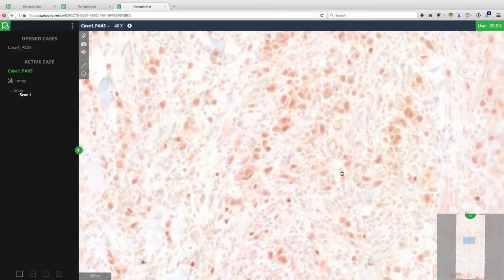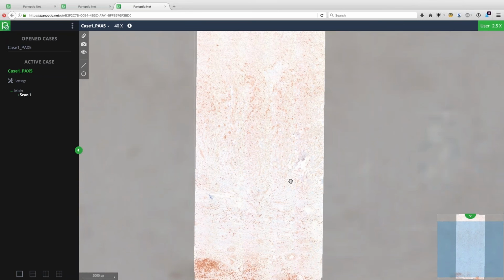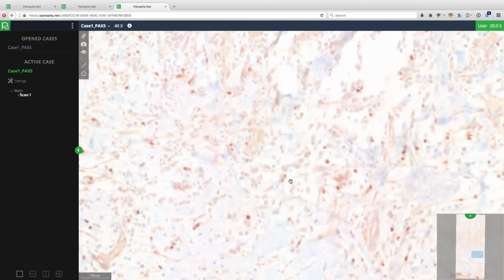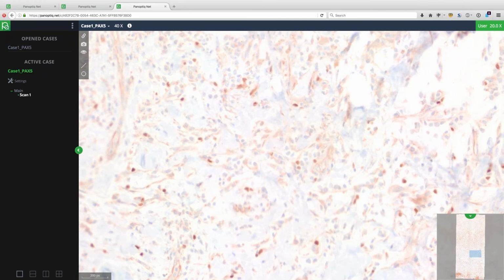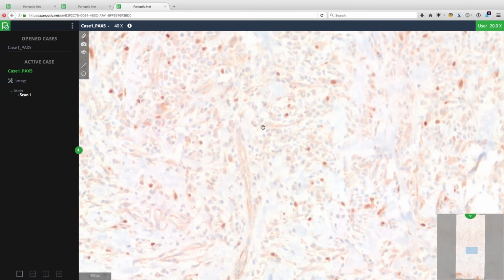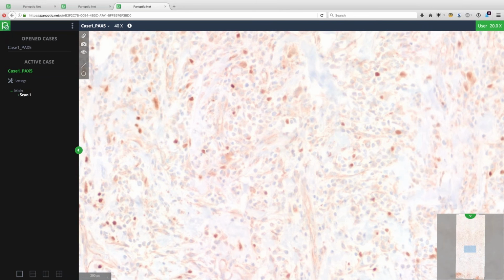Go back to that magnification, Richard, that was perfect. Zoom in just a tad bit more. These little dark dots on the screen, they'll come into magnification in a little bit. These are the background B cells. I don't know if the participants can see my cursor as I move it. Just keep it there, Richard. These larger cells that are faintly positive are the neoplastic cells of interest.